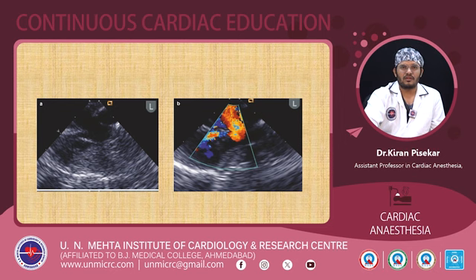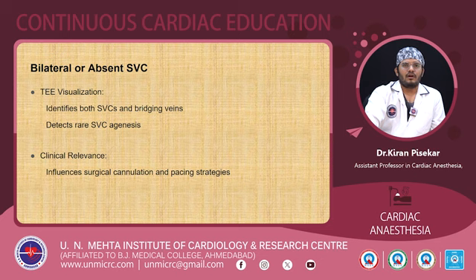Now here we can see the SVC. This is the SVC which is draining into the left atrium. Here again, color flow Doppler shows the direction of the color. So here is our TEE probe, and the flow is towards the probe. So the blood is draining from the SVC to the LA. Now again we can have bilateral or absent SVC. So TEE visualization identifies both SVC and bridging veins and detects rare SVC agenesis. It influences surgical cannulation and pacing strategies.